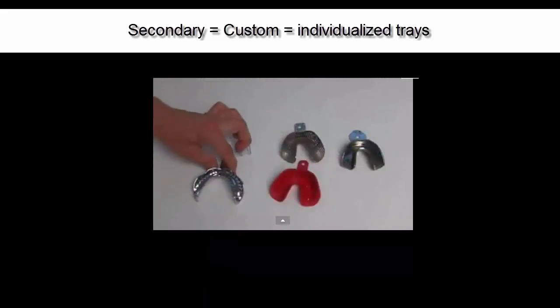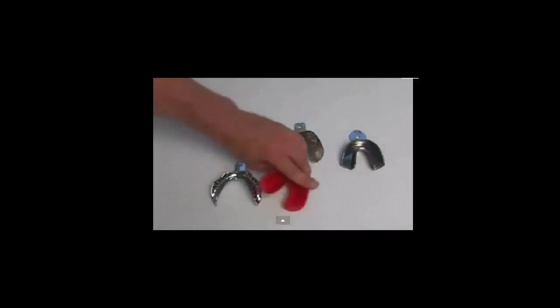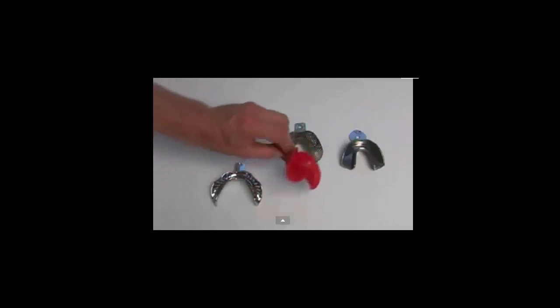The prefabricated trays are factory-made impression trays, made of metal or plastic materials, and come in a host of different shapes, for toothed, partially toothed, and toothless jaws.